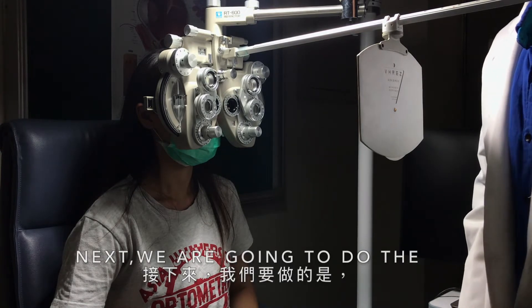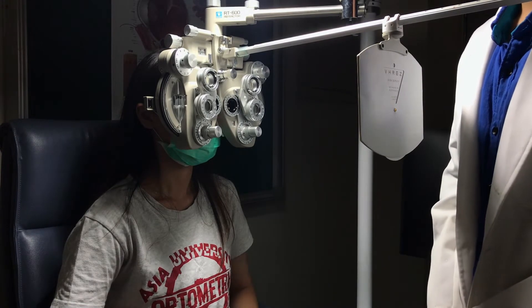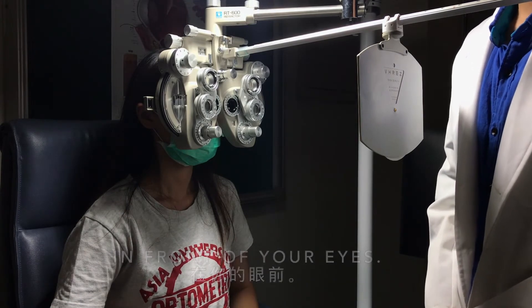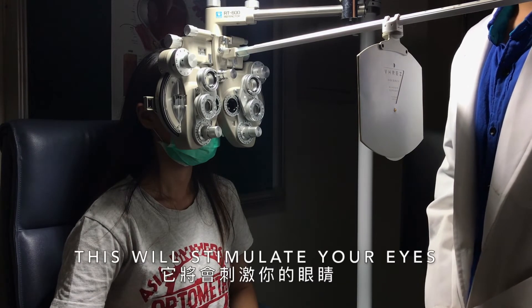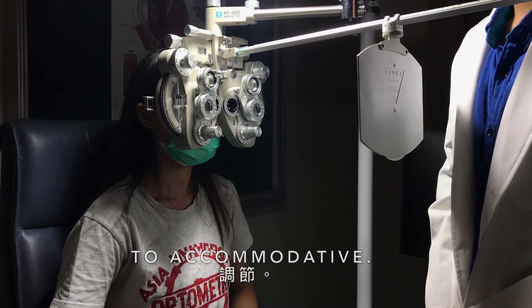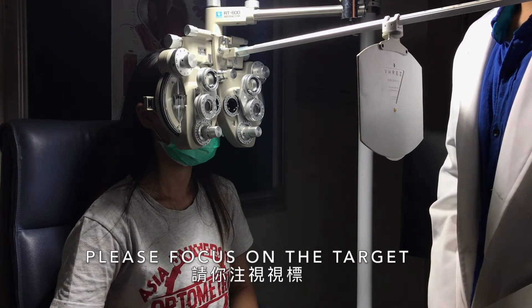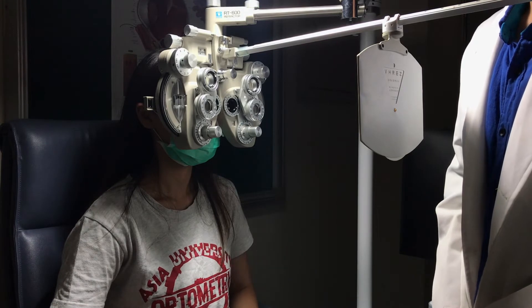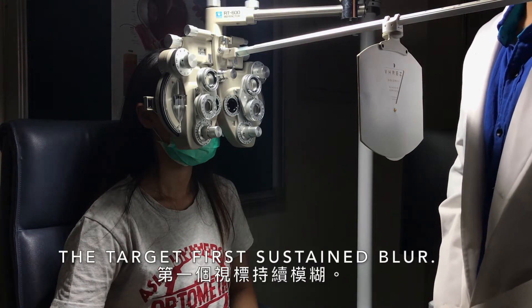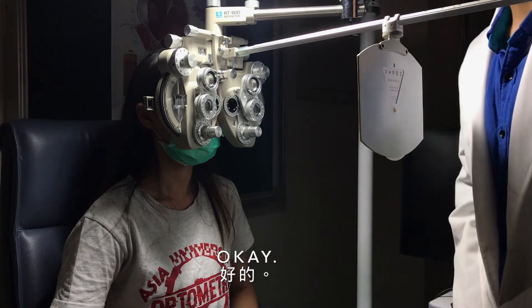Next, we are going to do the positive relative accommodation. I will add minus lenses in front of your eyes. This will stimulate your eyes to accommodate. During the exam, please focus on the target and keep it clear. When you see the target first sustained blur, please tell me. Okay.